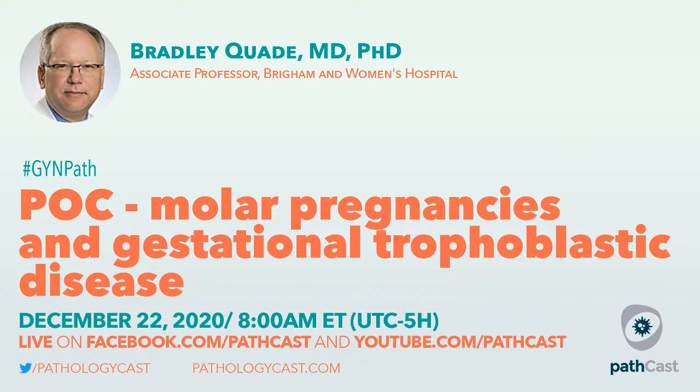What you're really looking for is that pattern that I showed you, where you get little patches of syncytiotrophoblast staining that gives you this kind of a hit or miss, dash-like pattern. That seems to be the pattern when there's positive staining. So if you're looking at something really wispy and you're wondering, is it, isn't it? It's probably not.